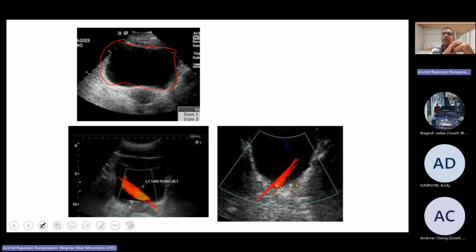Now I said it's very cool to look at, but if you do not have flow, it doesn't mean anything, because the patient might be having severe AKI. If they're oligoanuric, then you'll be waiting there for ages. You'll be there for 6 hours and you might not get a drop of urine. So it's like palpating for bowel sounds in the ICU fellowship exam. I tell my trainees never to do that, because if you don't have bowel sounds, you're going to be stuck there. But if you do get an image of this, then take it.